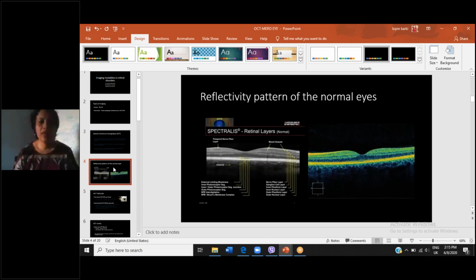Okay, so these are the two photographs I've got here on OCT. This one is the Cirrus OCT, which was quite popular about 5 to 7 years ago. This was a picture from one of those machines where we can see different layers of the retina, segmentation of the retina, which has been color coded. And this enables us to identify what's happening at different layers of the retina.